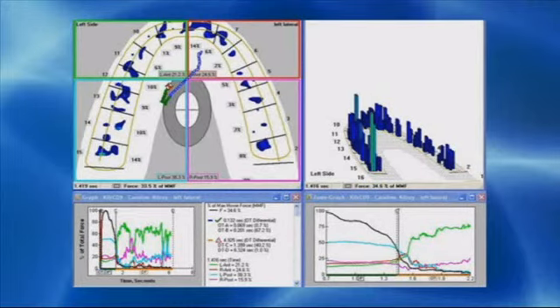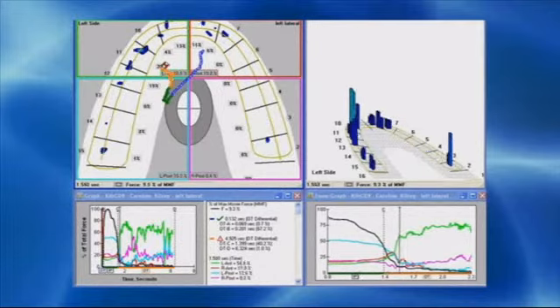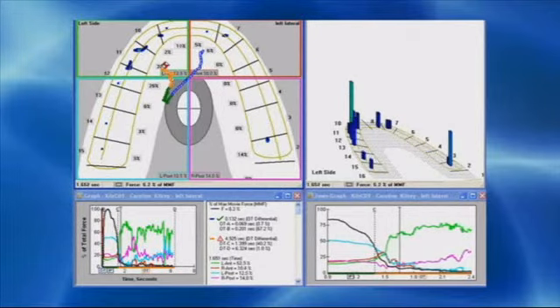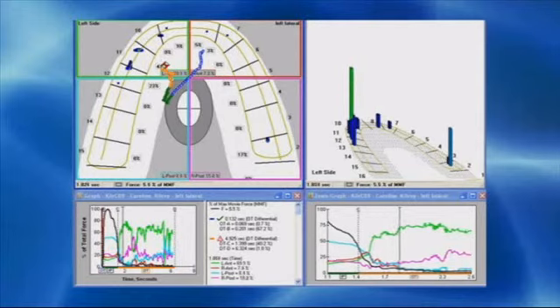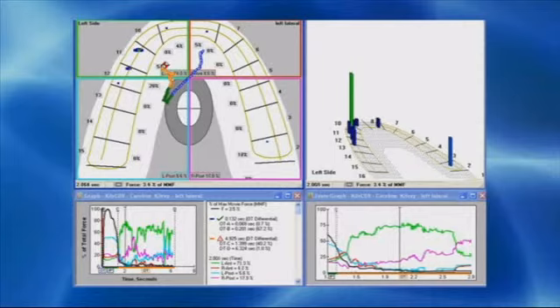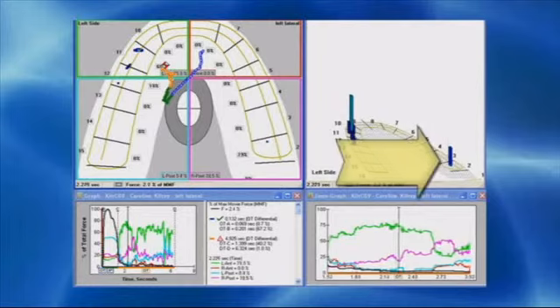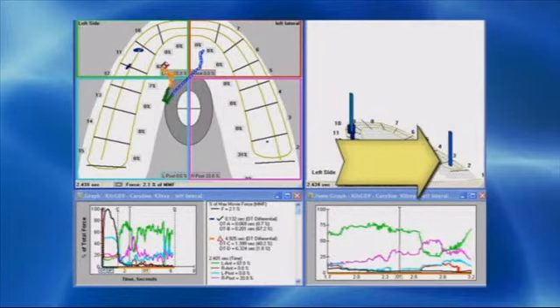And the left one is actually the reverse of the right one, because you have the same dilemma. When you move left, your right side stays together. So going either direction, you do not disengage your back teeth in less than half a second. And so this is what keeps your muscles active. And an optimum goal of occlusal therapy would be to reduce your time of disclusion down to less than half a second. That's an optimum physiologic health goal. And you can see it takes you, you never get off this tooth. You're consistently on this tooth.